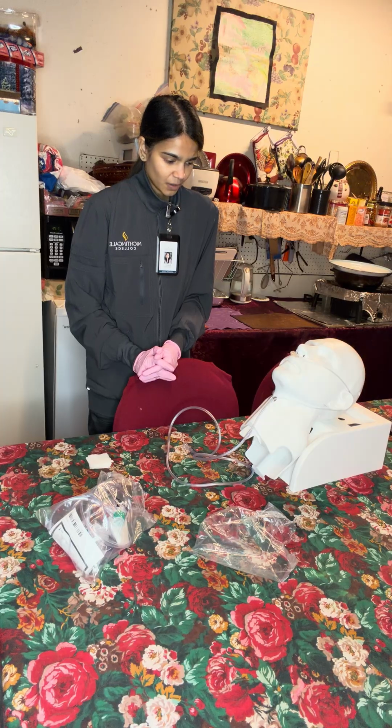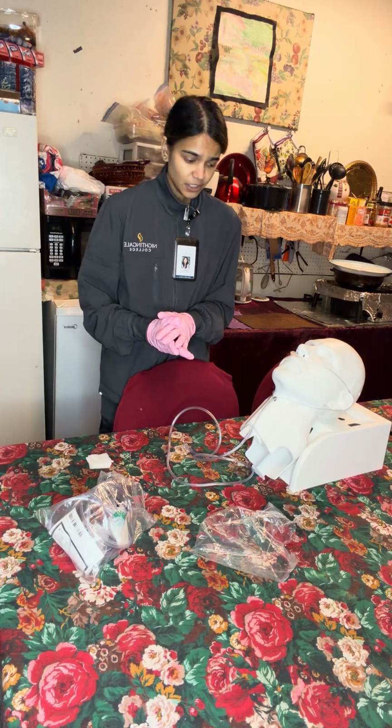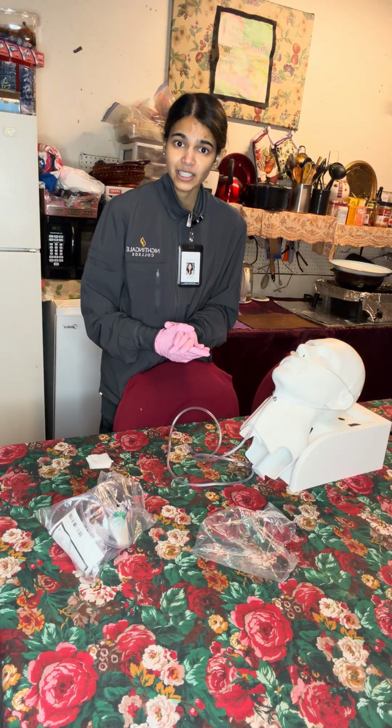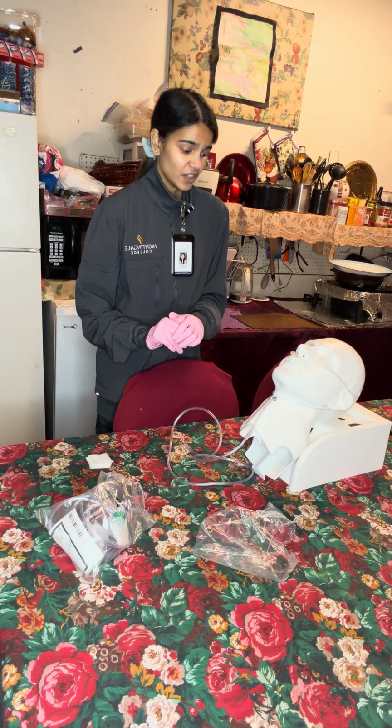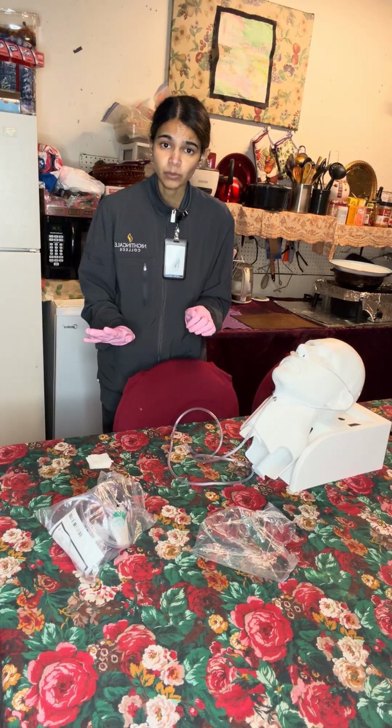Once that has been completed, I will be checking on the patient every 4 hours to ensure that skin integrity is in place, and to look for any redness, irritation, or skin breakdown.